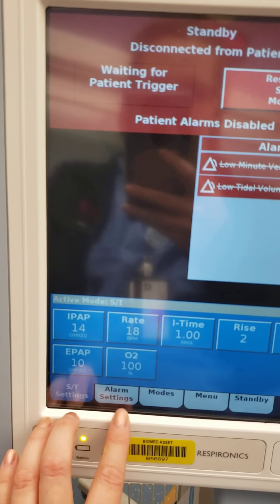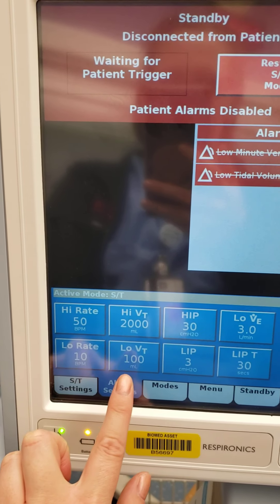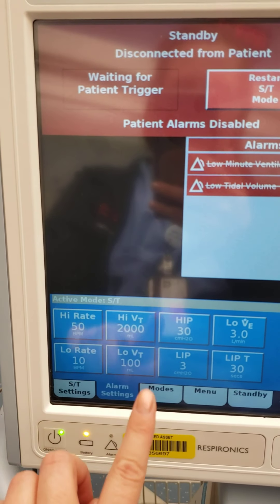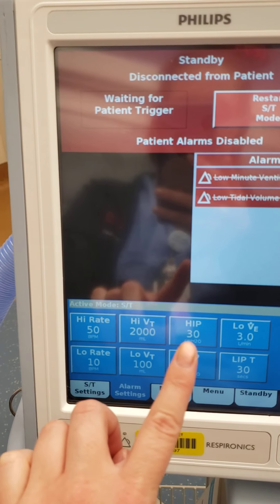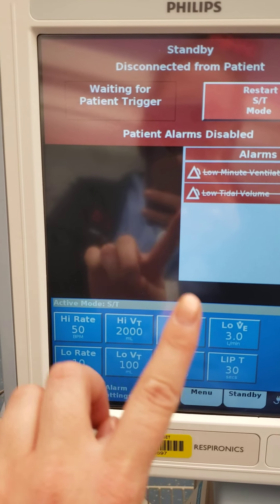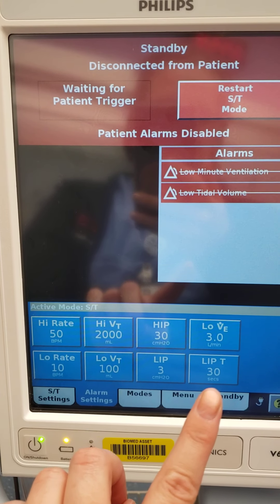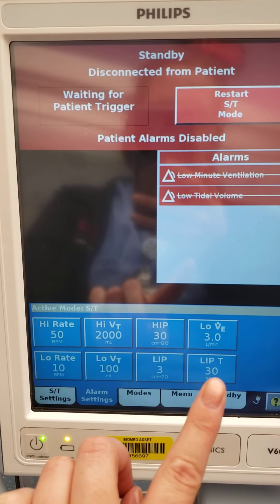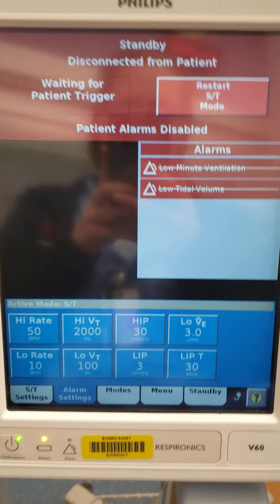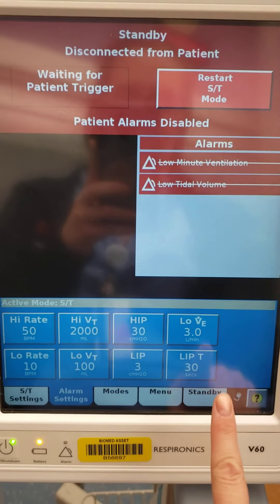Some other features: you can come down here and that will bring you back to your home screen settings. Here are your alarms — you have your high and low rate, high and low tidal volume, high inspiratory pressure, low inspiratory pressure, low minute volume, and time at low inspiratory pressure. Basically that's just a disconnect alarm — so after 30 seconds of being disconnected, our BiPAP will alarm that we are disconnected.